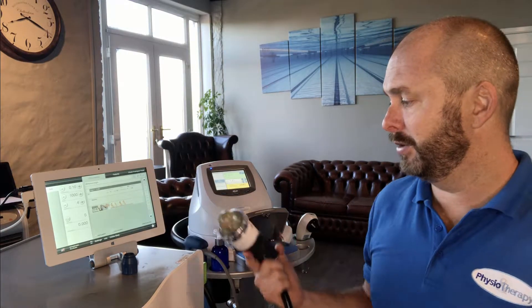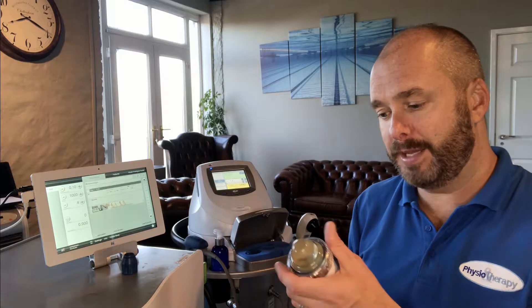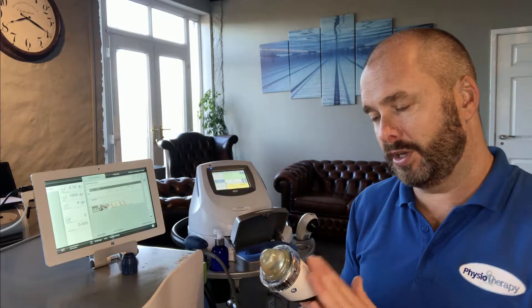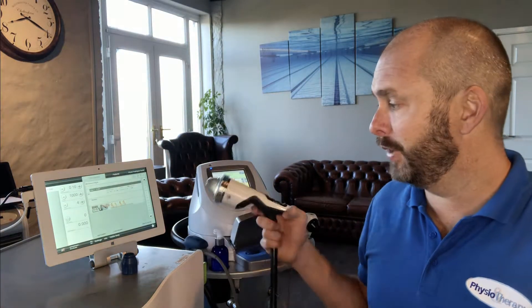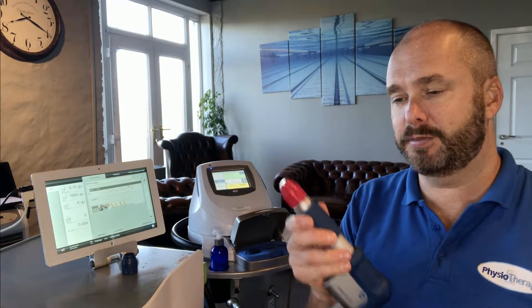I've treated high hamstrings very successfully with the radial, but I probably need more sessions and a really high energy, which is quite painful and can mark the skin unless you keep gel in the way. The focused machine is much more able to do that treatment — it's not working at its maximum and it's a lot less painful for the patient — but you do have to make sure you're angling it correctly.